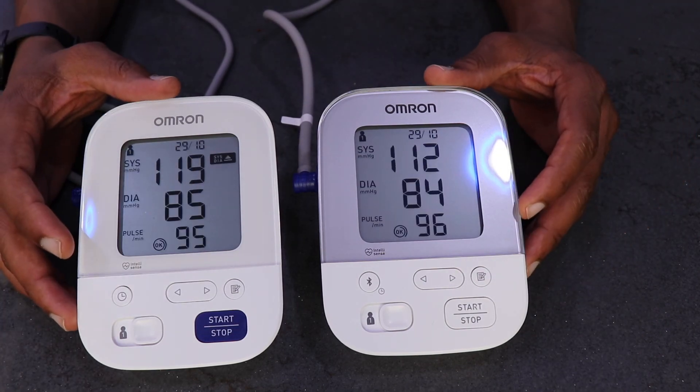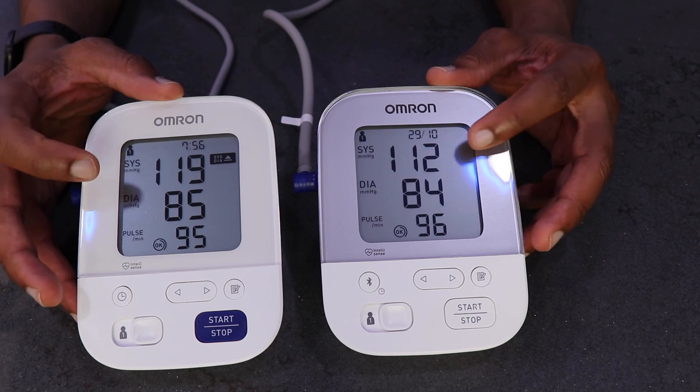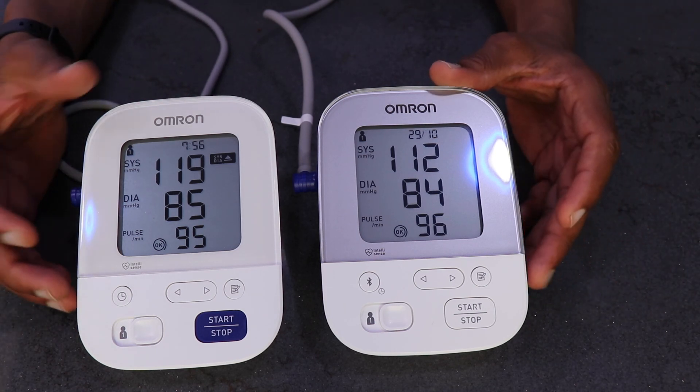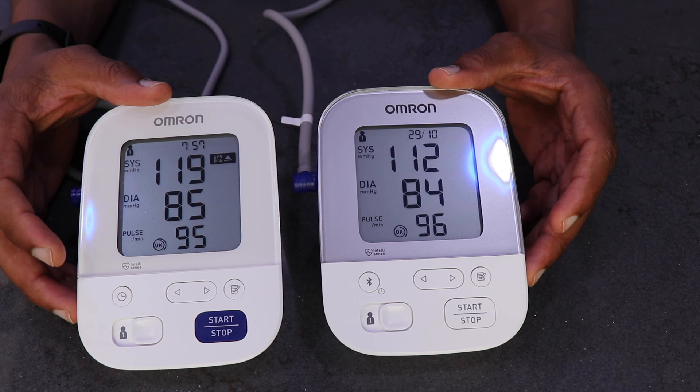The fourth reading is almost the same again. The main disparity is between the systolic readings on both arms. The conclusion I came to is that it really doesn't matter whether you take your blood pressure reading on the left or the right arm — it's your choice really.